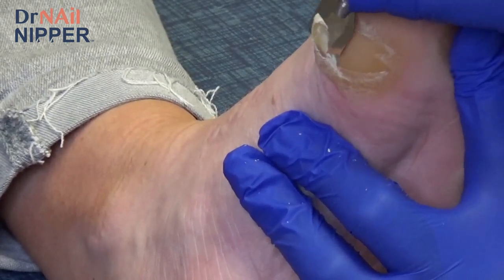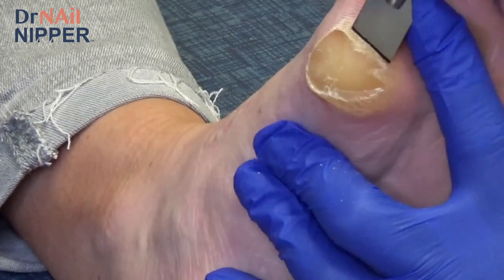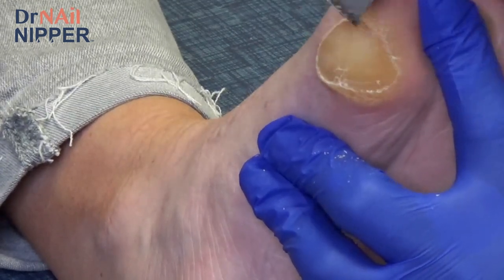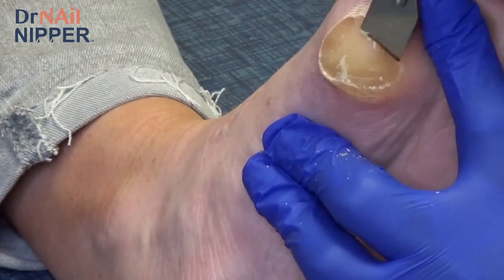So just out of curiosity, did the other doctor use this kind of blade also? It was a little thinner. A little thinner, okay. But that flat edge? Yep, the flat. Interesting, okay. Yeah, because you only ever see these kinds of blades in podiatry, pretty much. They're called chisel blades.